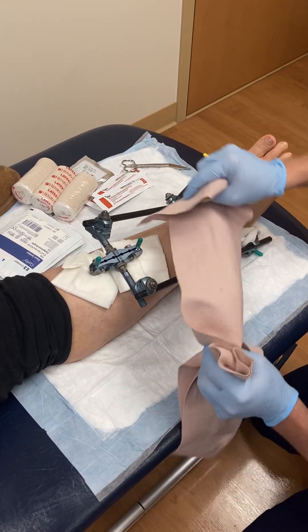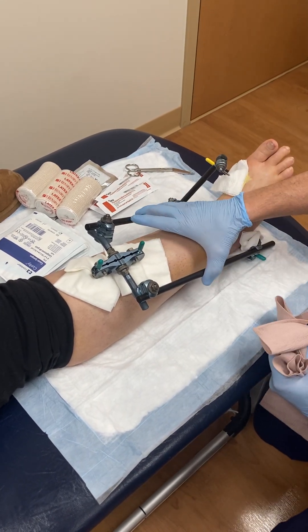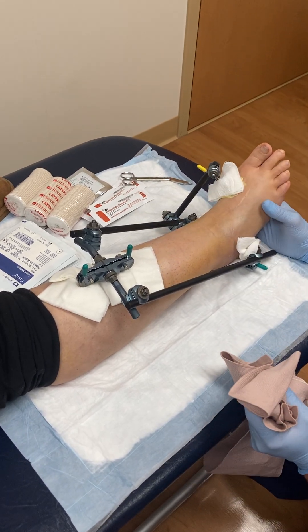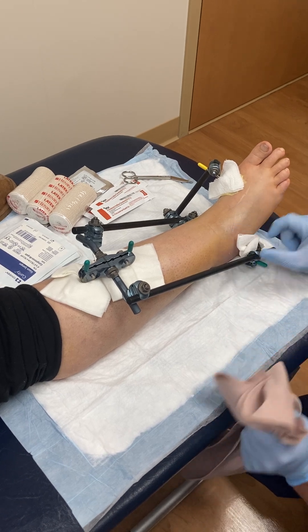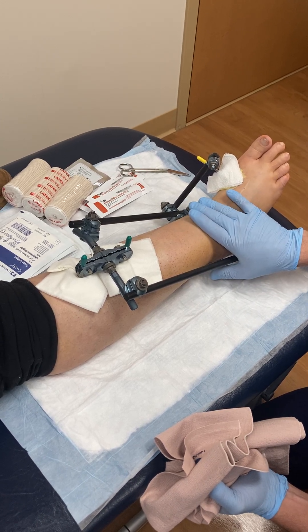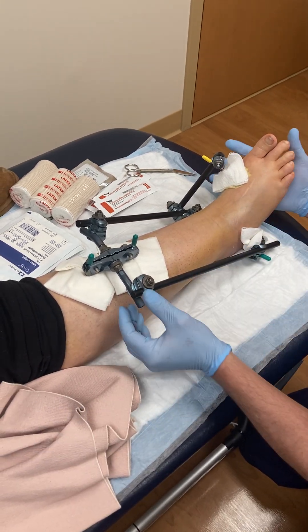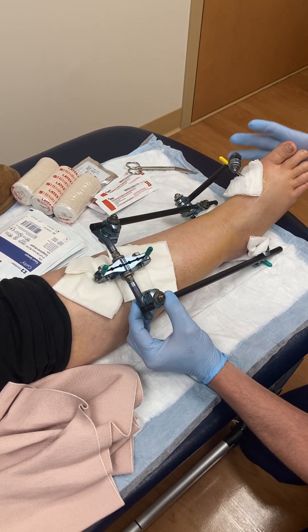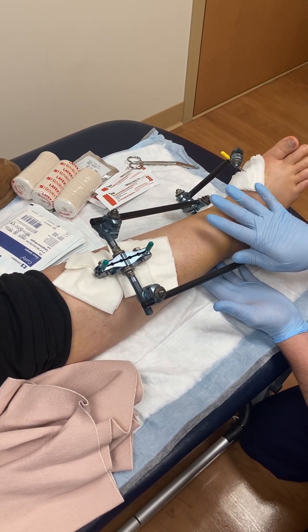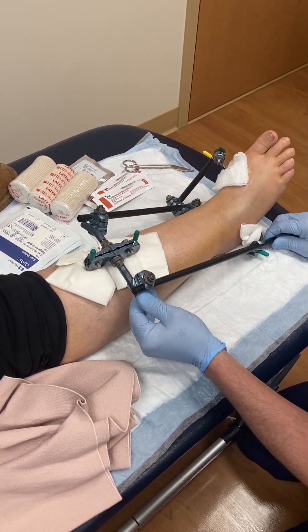I'm Dr. Stewart Kerr and I'm here at Fairbanks Memorial Hospital with one of my favorite patients who, like myself, sustained an ankle fracture-dislocation on her right leg. I had mine several years ago, and for this patient her leg was too swollen to safely do the repair. Sometimes with that type of repair we have to put an external fixator in place to allow the soft tissue swelling to resolve before we do definitive fixation.